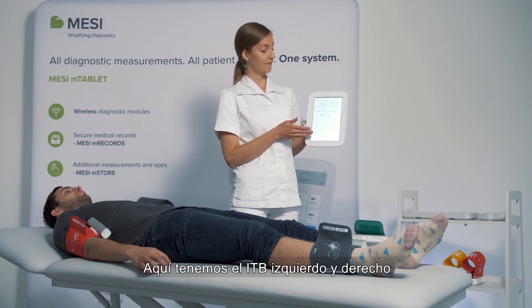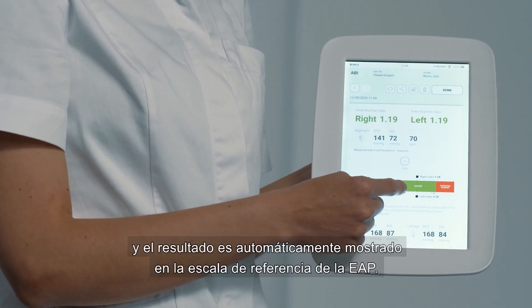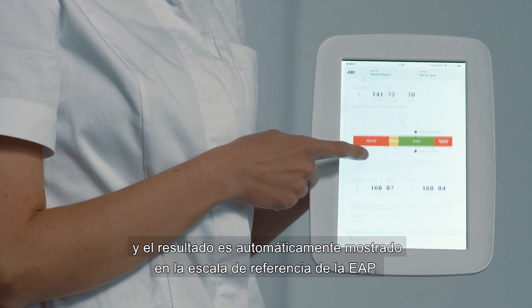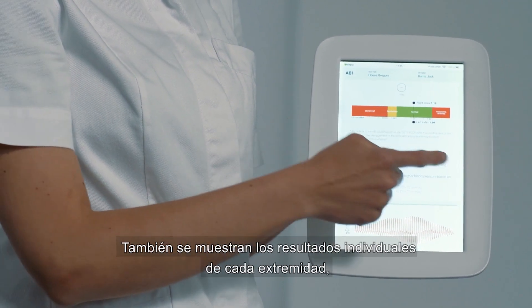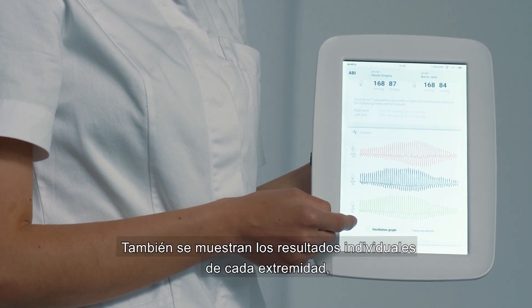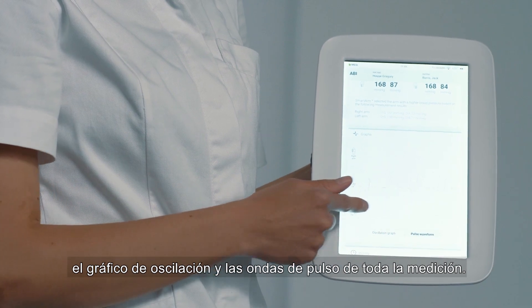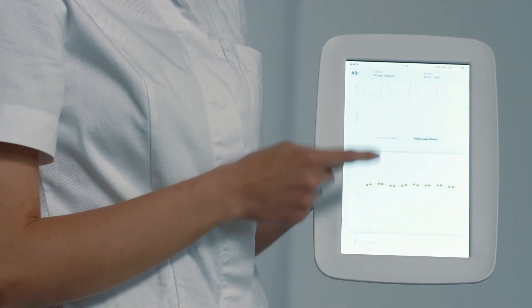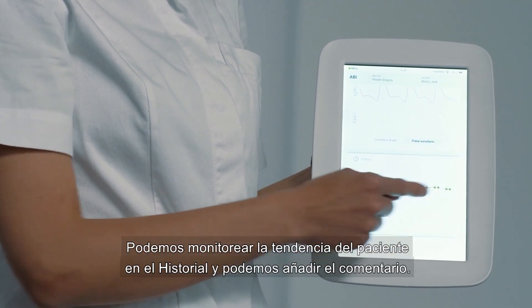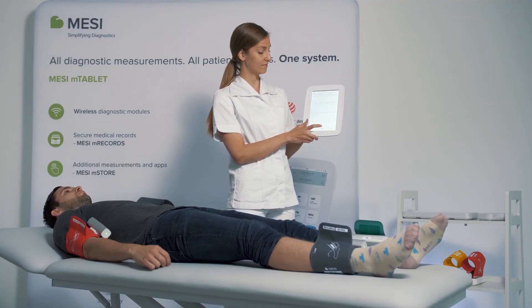Here we have the left and the right ABI. The result is automatically put onto the PAD reference scale. You also receive individual pressures in all the extremities, as well as the oscillation graphs and pulse waveforms for the entire measurement. You can monitor the patient's trends through the history tab and you can add any comments that you have.